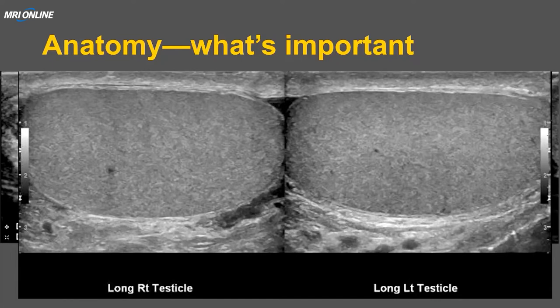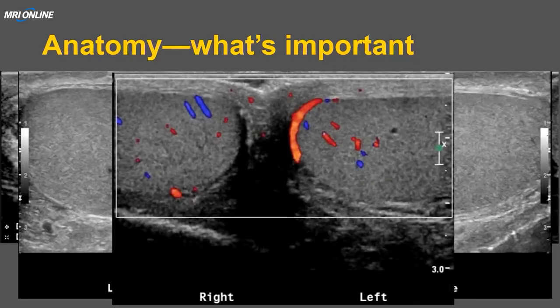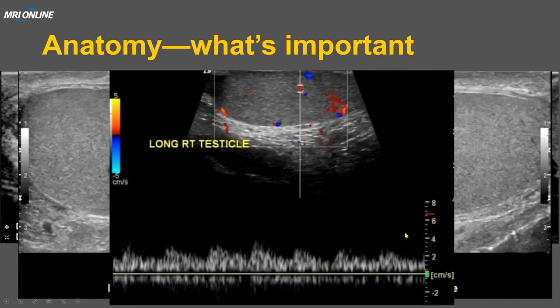Optimize all your settings for the asymptomatic testis, then look at the other side and compare the symmetry or asymmetry. There should be symmetric flow. If you look at the testis itself, there are little dots of red and blue — arteries and veins — and it's very symmetric when you compare the same area within the testis to itself. A slightly larger vessel on one side doesn't necessarily mean asymmetry. With pulse Doppler, you should get a nice continuous waveform with continuous diastolic flow that's low resistance.